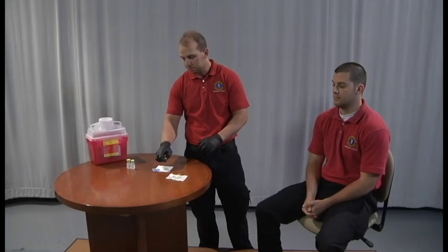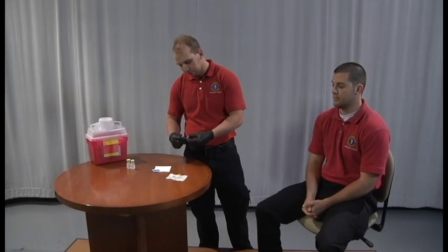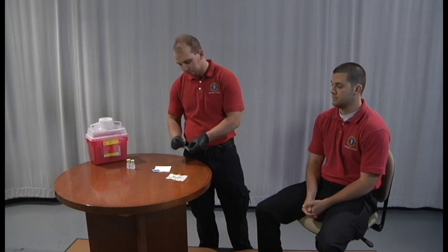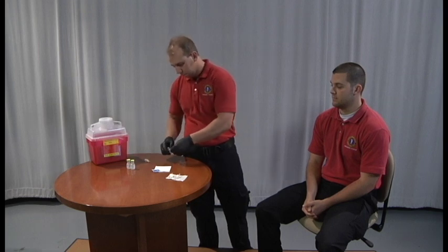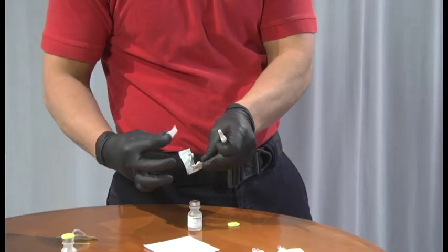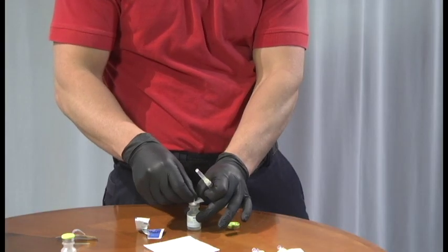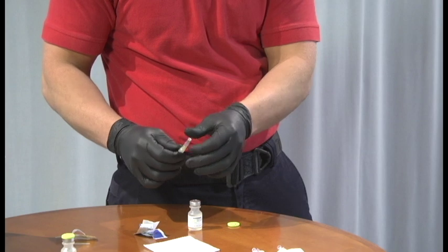Assemble the needle and syringe. Cleanse the rubber stopper and draw up the appropriate volume of the medication into the syringe.